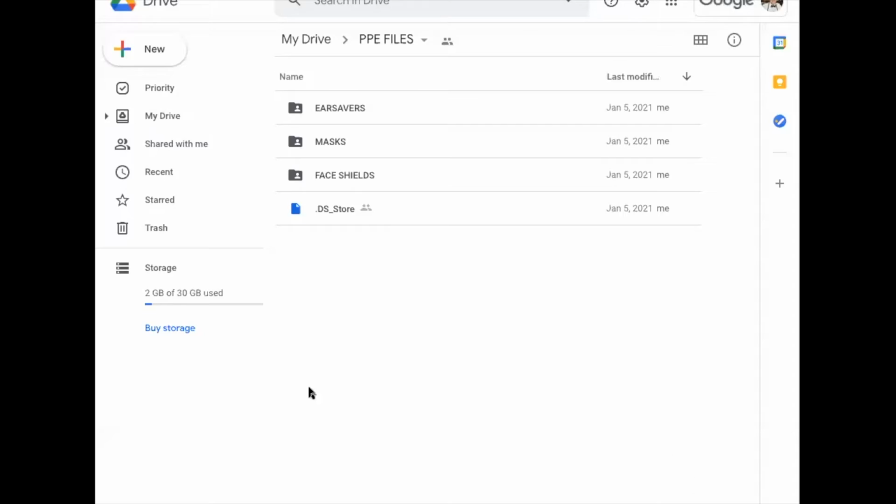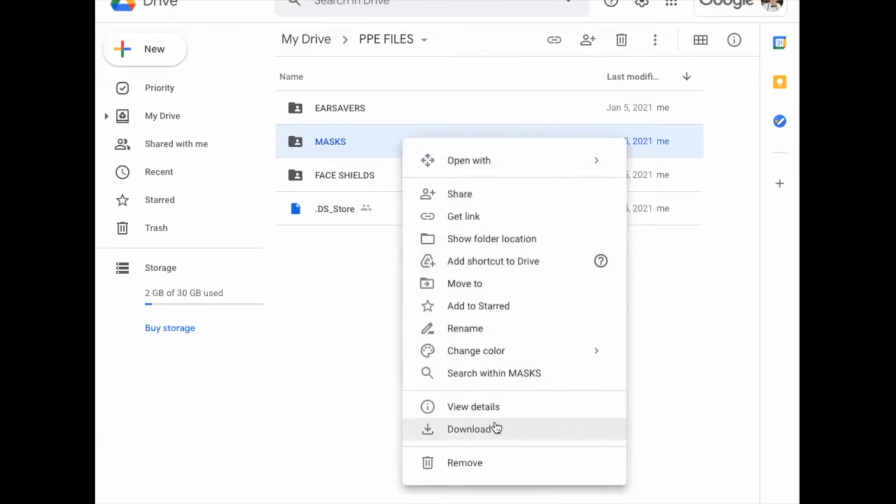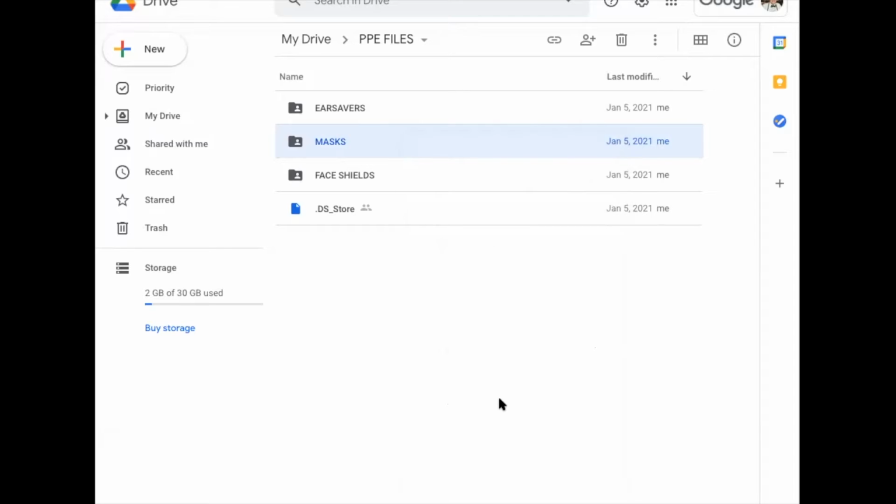To make a Breathe3D mask, go to the DBU Google Drive with all of the PPE 3D print files. When you get to the Drive folder with the PPE files, highlight all of the folders, right-click on the mouse, and click Download. Wait for the zip file to download to your computer. Then click the zip file to open it.